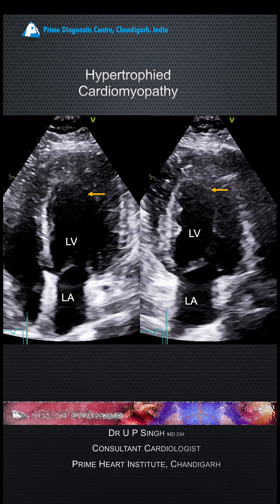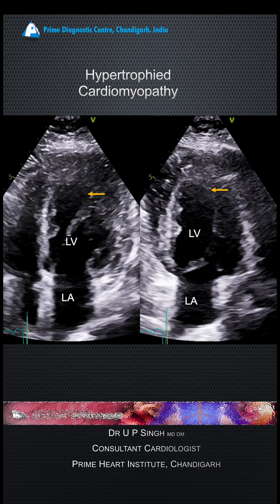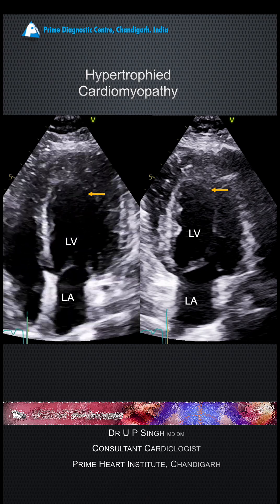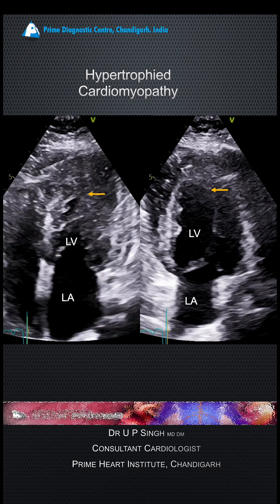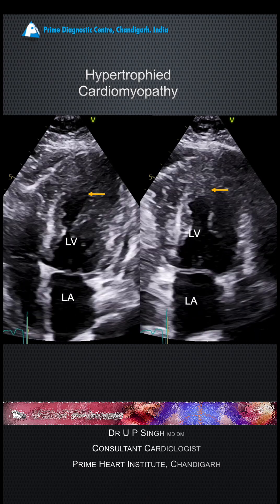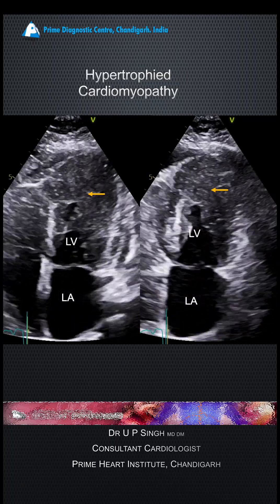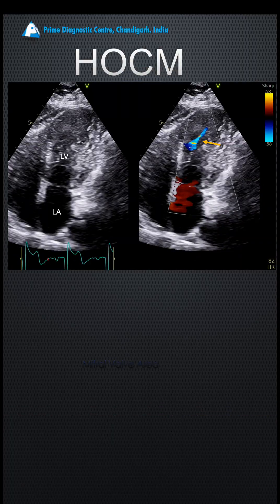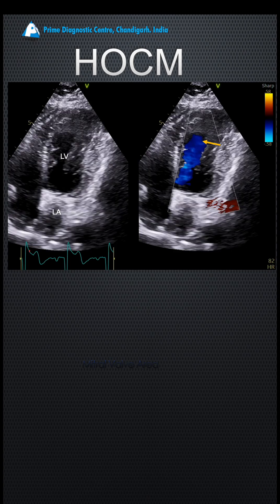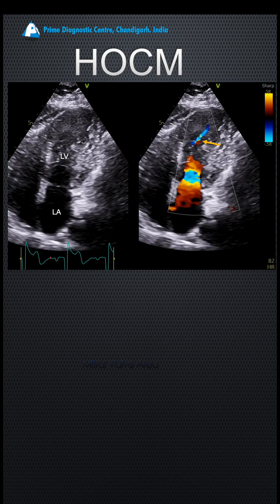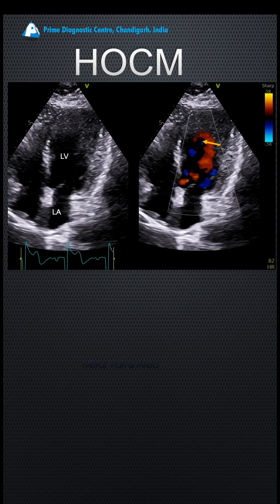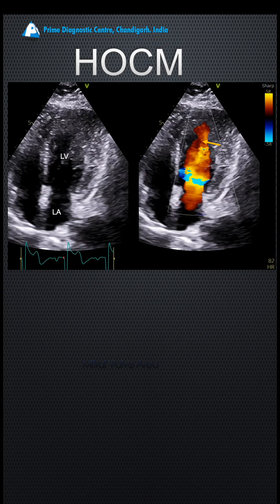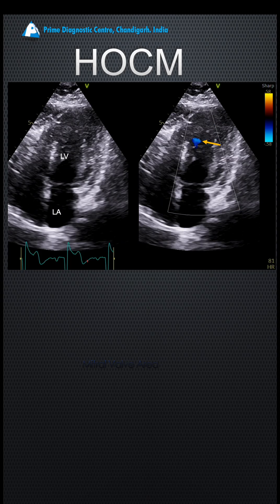I'm sharing a young male who presented with apical cardiomyopathy. Look at the hypertrophy of the apices both on a four-chamber view and in a two-chamber view. The bases are fine, not thickened, but there is hypertrophy at the apex. On color Doppler, you can see there is aliasing at the mid LV cavity close to the apex, indicating there is an obstruction in systole.